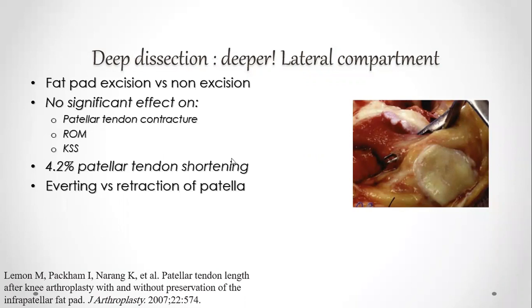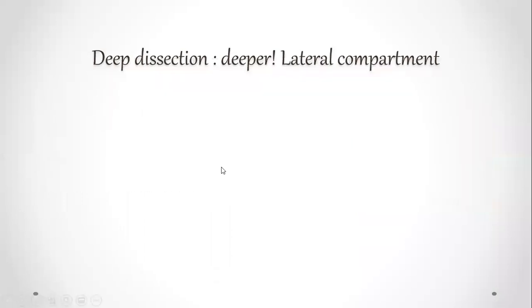4.2% patellar tendon shortening was found in one of the literature, as you see in 2007, and that's why they leave the fat pad without excision. Whether everting or not, some surgeons suggest that you evert it, and some use retraction only. This depends on your experience.